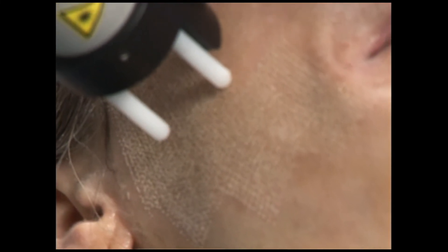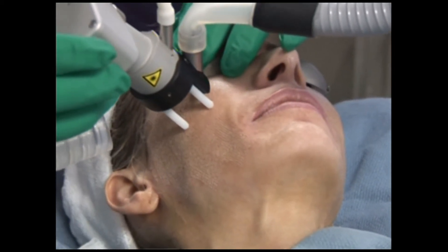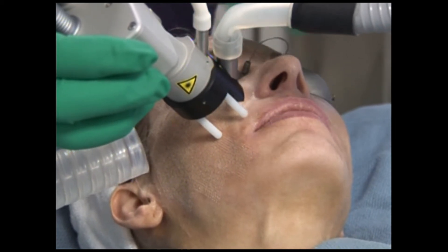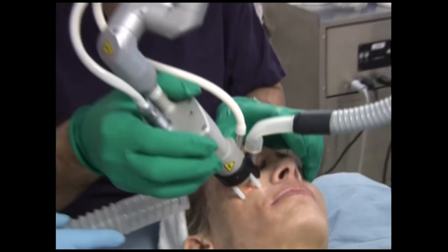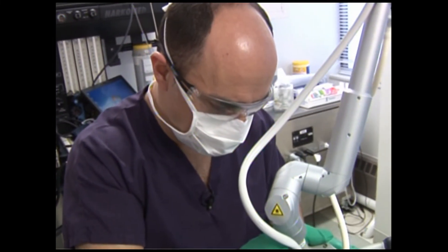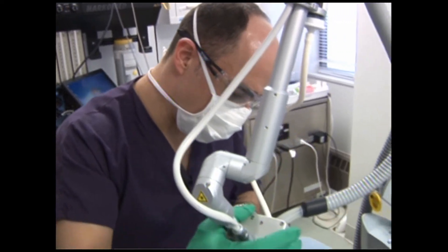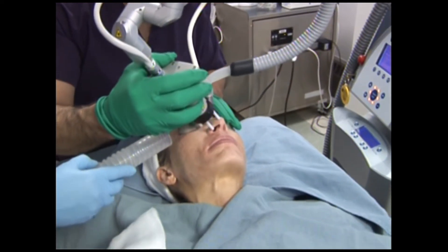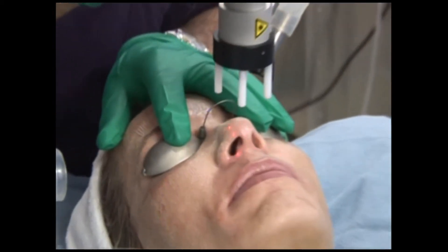What will people expect after the treatment? We're going to put a bunch of gooey ointment on the face. In the first three or four days, you have to use a lot of that ointment to keep the face from drying. The first two days are really the worst as far as redness and swelling. She'll get a little bit of pinpoint bleeding, redness, and swelling. The pain really isn't too bad unless the skin dries out, so you have to work to keep the skin from drying out.